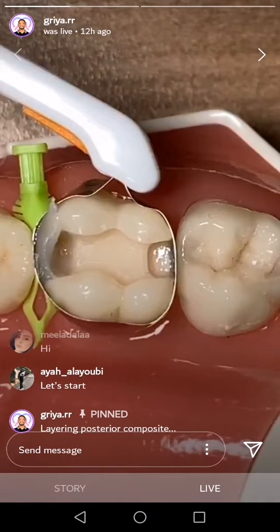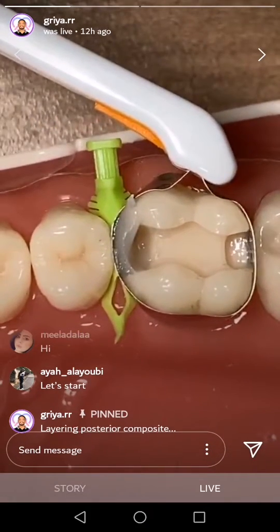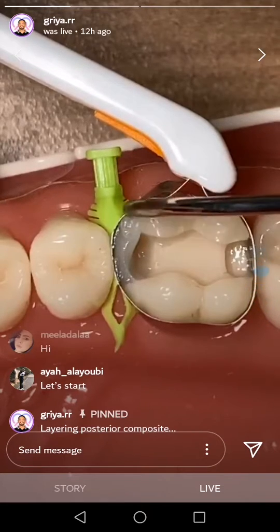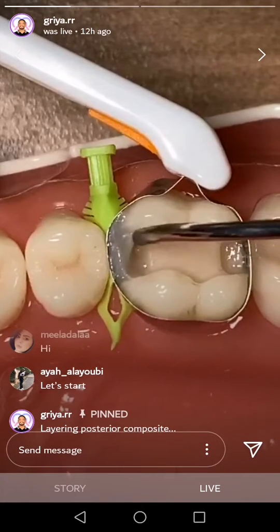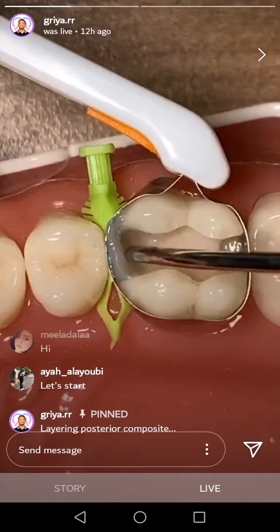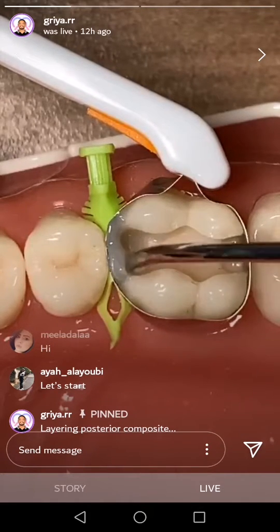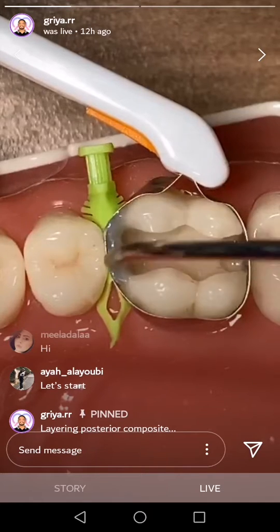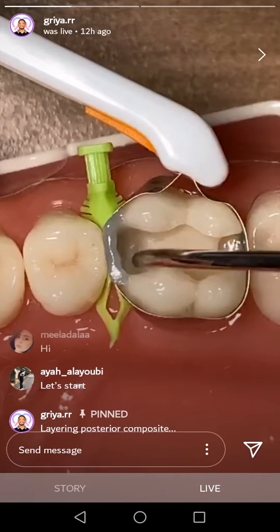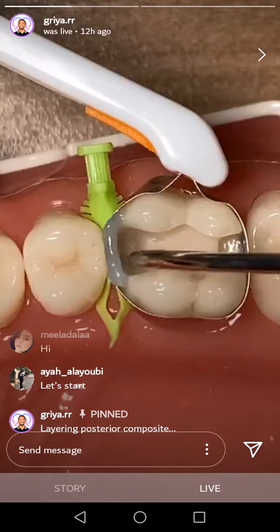I love putting extension, because extension means you have a good adaptation. Maybe I'm bilingual because I'm from Indonesia. If it is packed like this and pushed to overflow, it will become homogeneous.